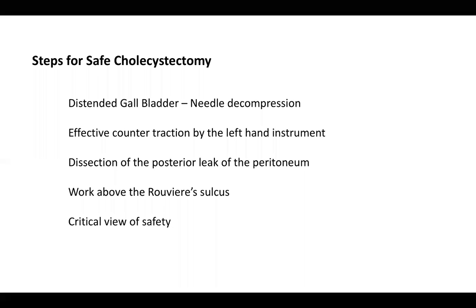And this is something that all beginners should be cognizant about. Please, you're operating with both hands when you're doing laparoscopic surgery. So use the left hand effectively. It makes life a lot easier. Dissect the posterior leaf. Sorry, it's not leak.